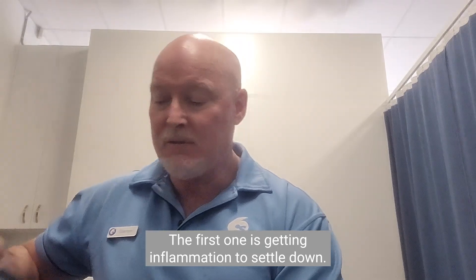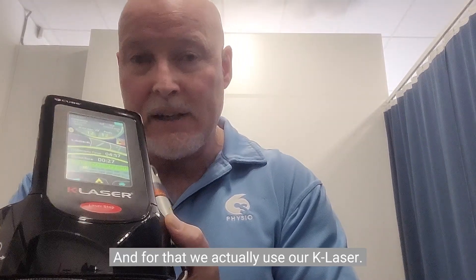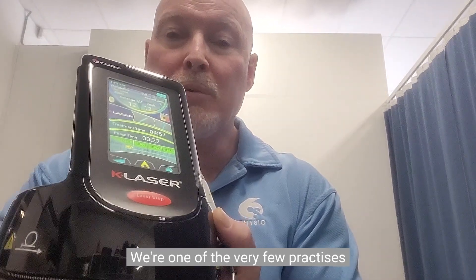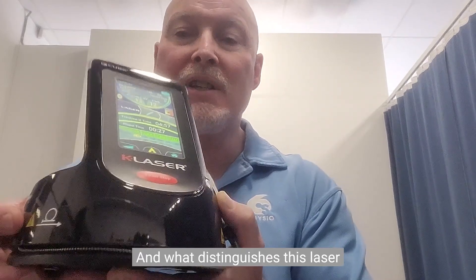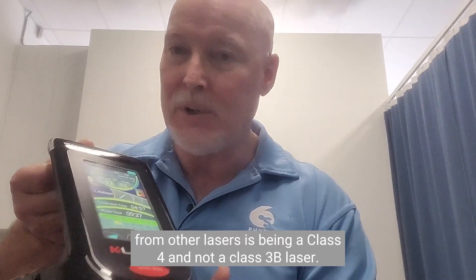The first option is getting inflammation to settle down, and for that we use our K-Laser. We're very proud of our K-Laser — we're one of the very few practices in New South Wales, much less Australia, that actually has a class 4 laser. What distinguishes this laser from others is being a class 4 and not a class 3B laser.